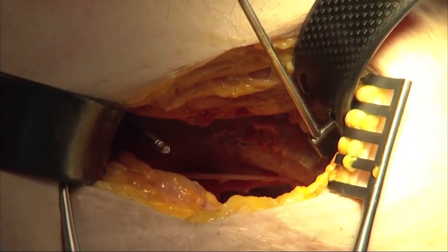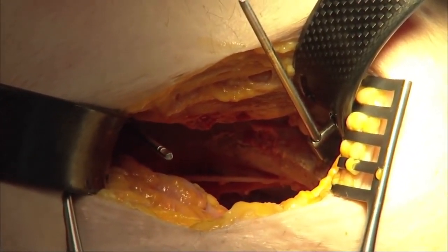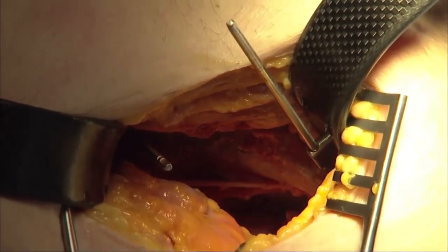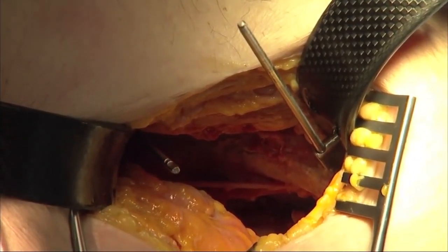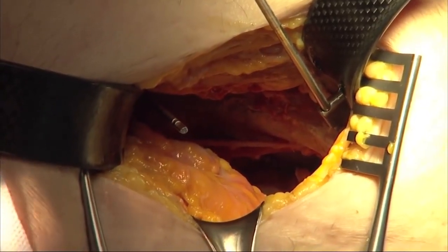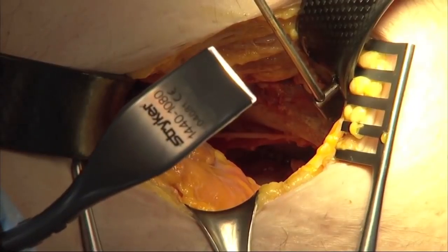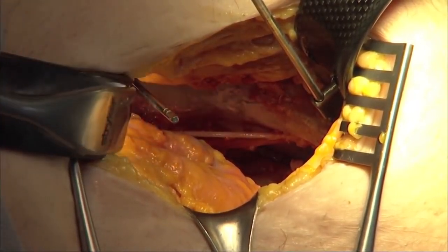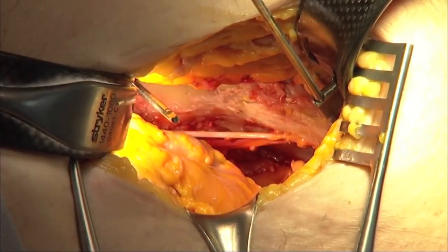Because it's such a deep hole and the lighting is difficult, it's a little difficult to see, and in fact, this is one of the issues or the problems that we tried to get around with the new system. And that is the light pipes. The light pipes are going to attach to the carbon fiber retractors and help us with illumination of the surgical field in the wound. The light pipes snap right into the retractors and are held in place with the small slots and the clips on the light pipe itself.